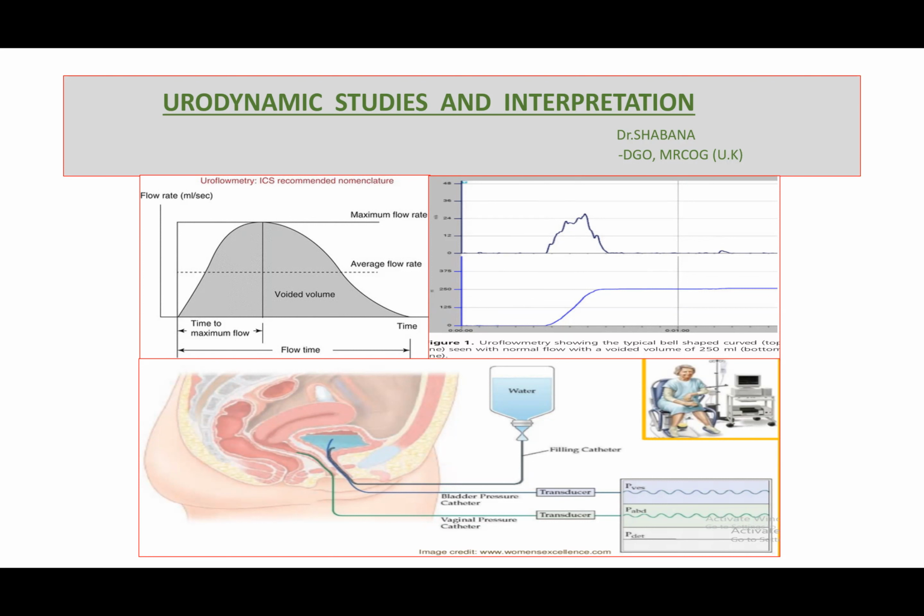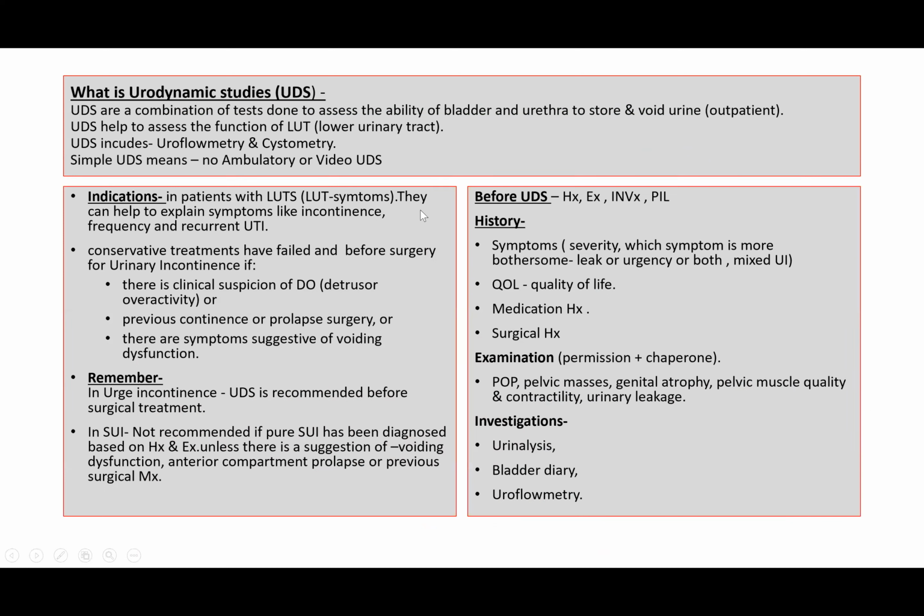This is also a very important exam topic, and I know sometimes when we get the graph in the exam, it is very difficult for us to interpret. So again, I have tried to keep it as simple as possible. So let's have a look at what urodynamic studies are.